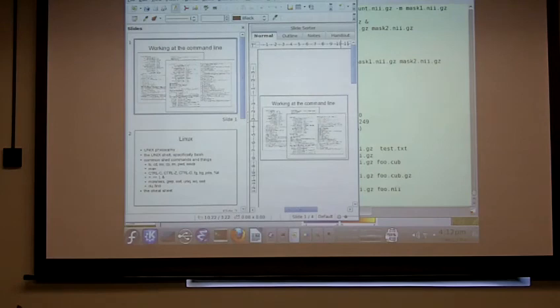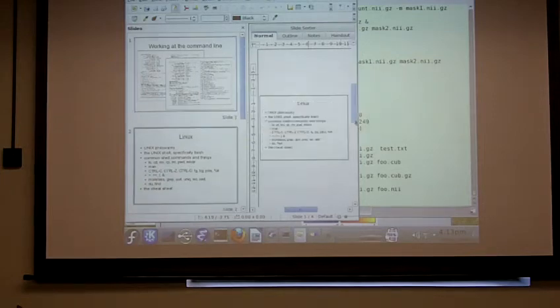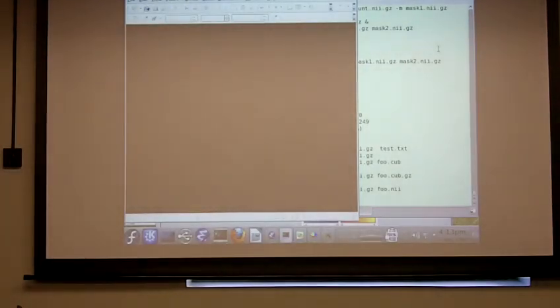Some people say left-handed coordinate and right-handed coordinate, in terms of image orientation. And I don't know what that means. This is why, when somebody tells me something about orientation, I usually ask a lot of questions, because frequently image volumes have been through a lot of transformations by the time.